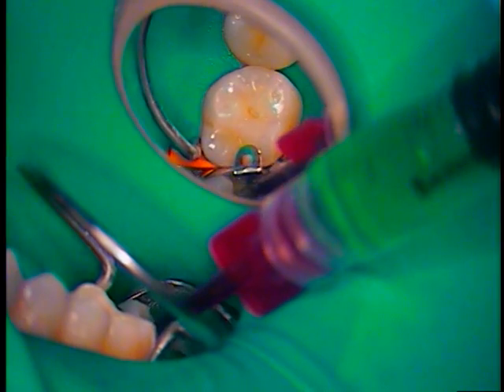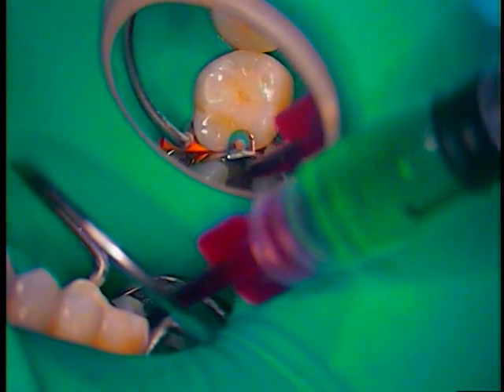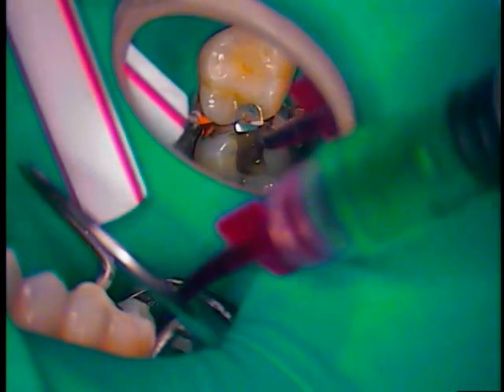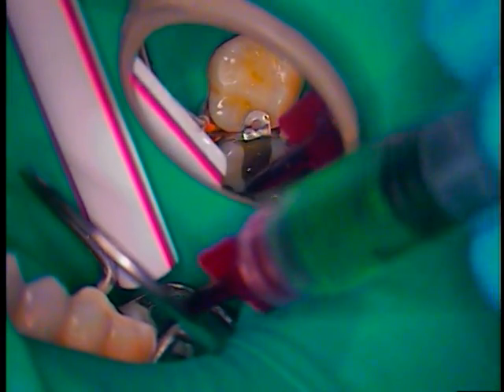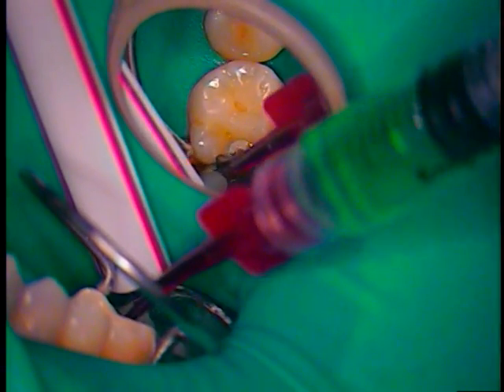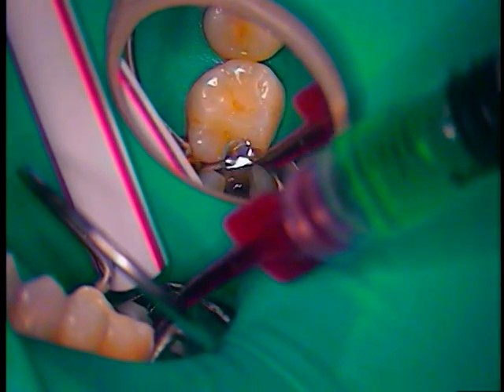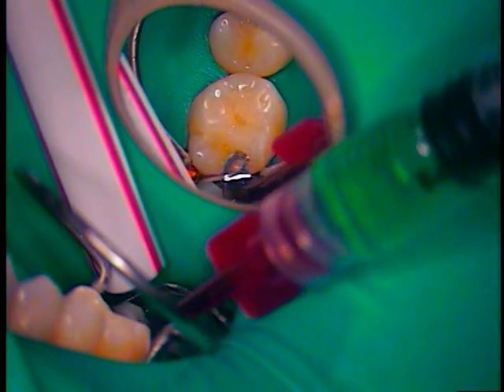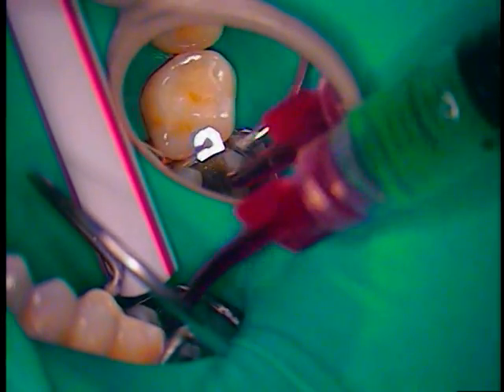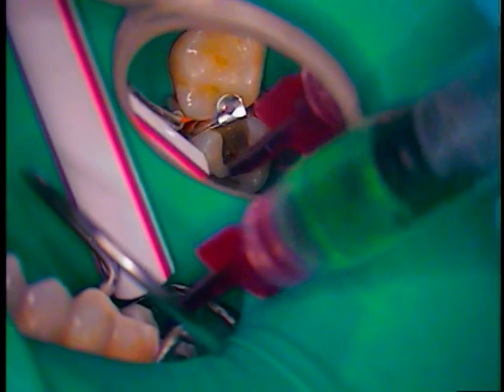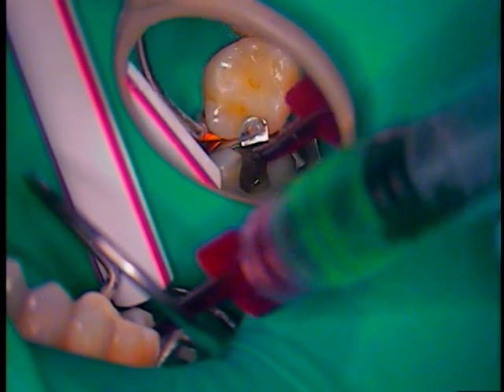I'm gonna go back in with my cleaner, get rid of the blood before it starts to coagulate, scrubbing everything. Now we're gonna definitely put it down as a future crown. Once I saw that fracture and the size of this filling, it will stay as the buildup. Rinse again.